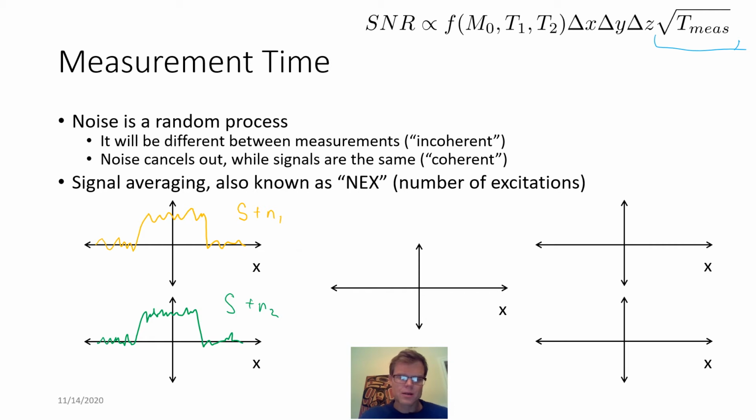So let's go ahead. You can look at this as the effective measurement time: in this model, we're going to add these two together. And what are we going to get here? It's a little hard to illustrate, but we'll get some measurement that's going to have 2 times our signal, but with the addition of these 2 different noise patterns here. Great.